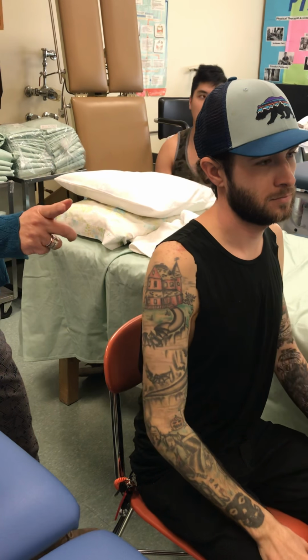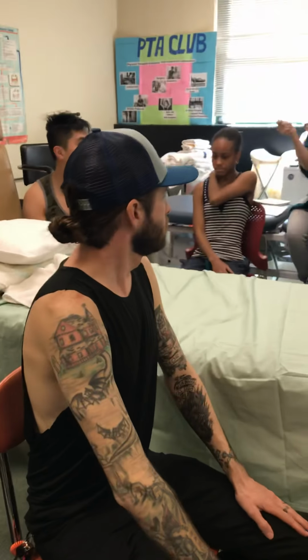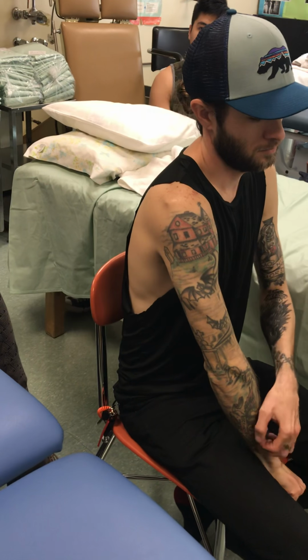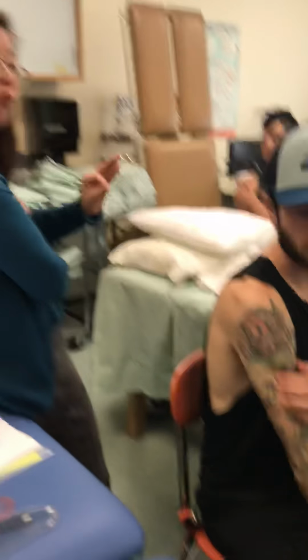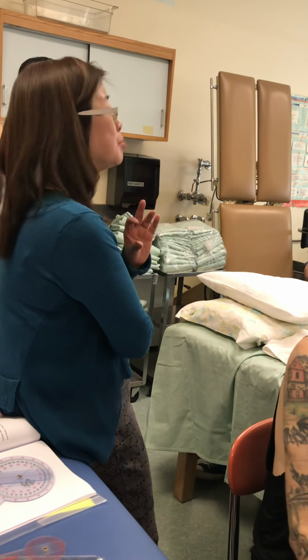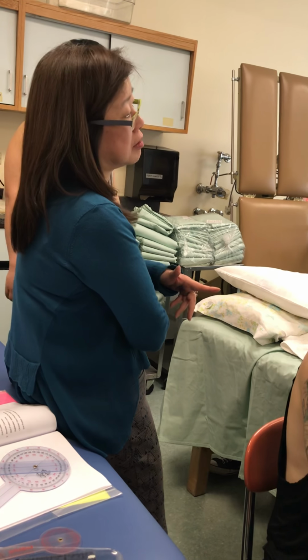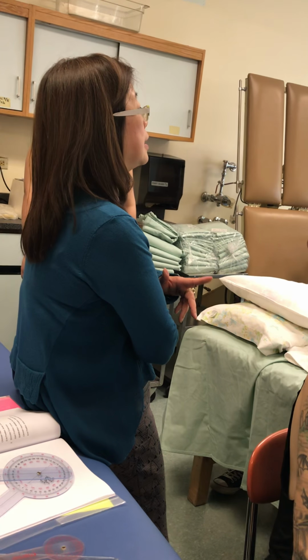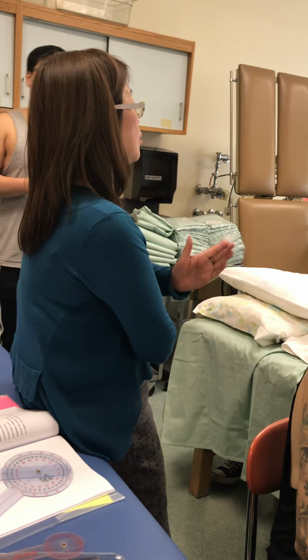Right, questions? Do you always have to follow with them? No. I'm doing it that way more for you guys right now. What I need you to do is make sure you know what your starting position is, because not everybody starts at 0, remember. He didn't start at 0 for internal/external rotation. He was in an externally rotated position, about 1 degrees of external rotation. So that's why I follow it along.